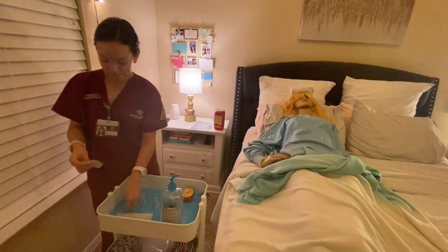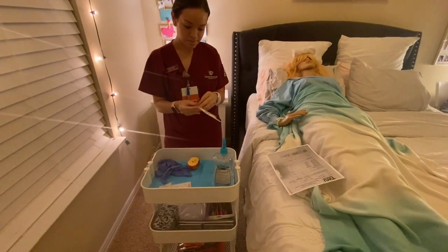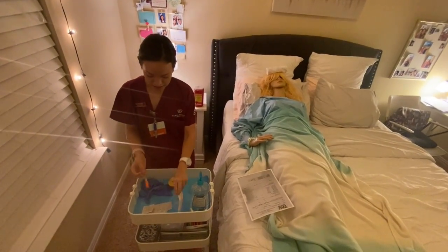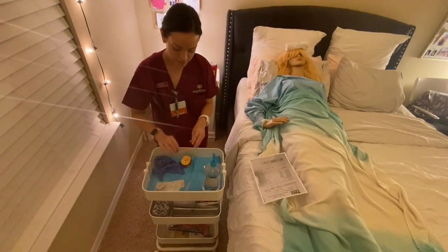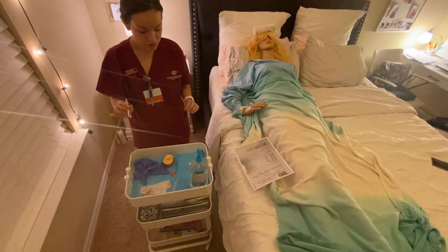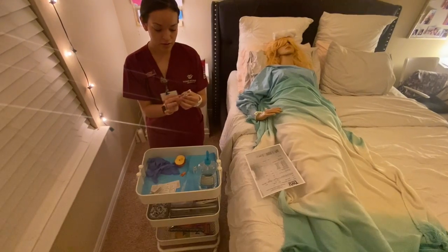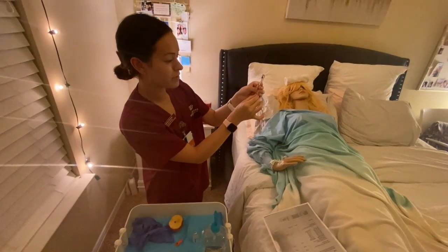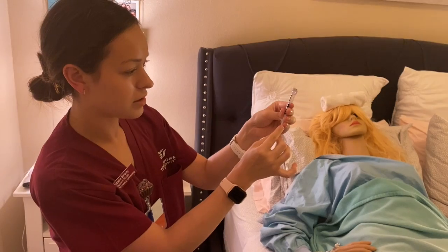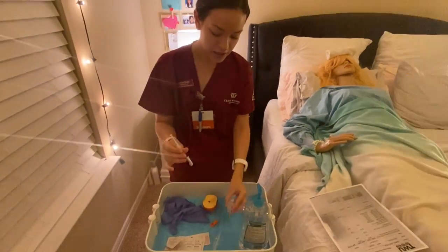Okay. I'm going to open my syringe. Okay, and going to, of course, uncap it. And I'm first going to begin by inserting 30 units of air into the NPH vial. And I'm just going to keep it at eye level and make sure that the top of the plunger is at 30 units. So I'm going to put 30 units of air into the NPH. I'm going to keep it down.